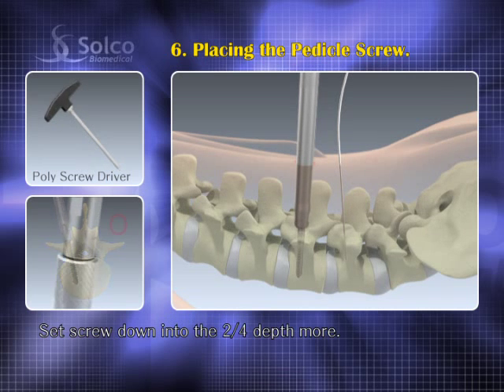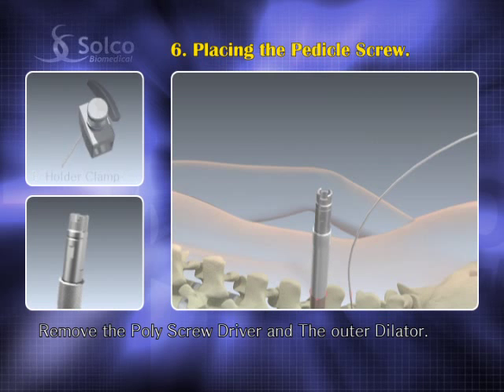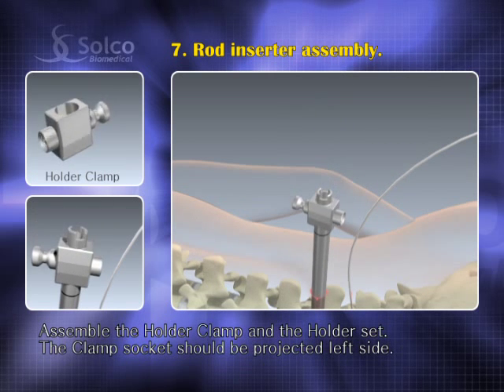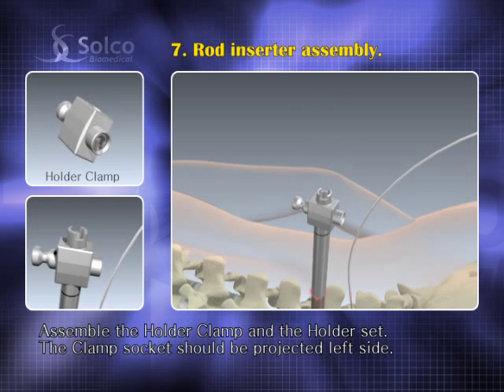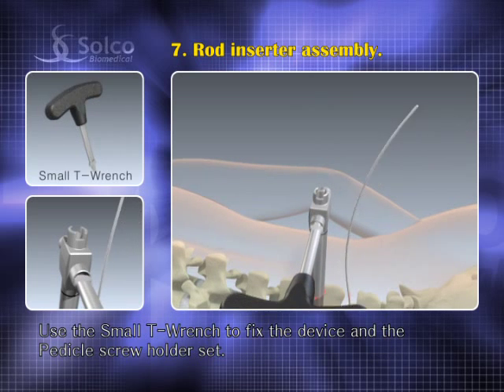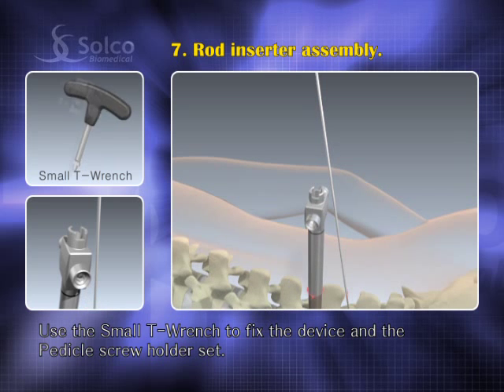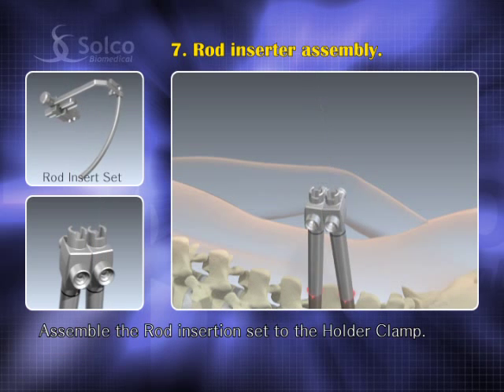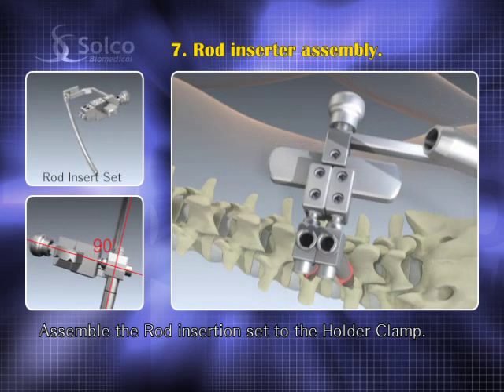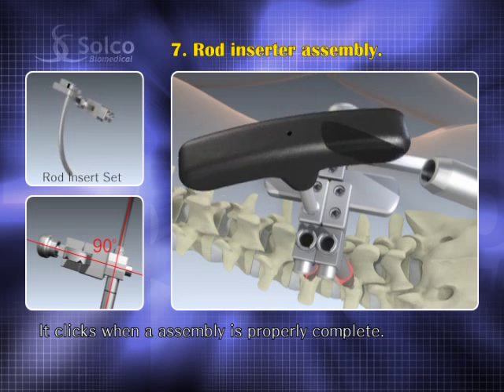After that, remove the poly screwdriver and the outer dilator. Assemble the holder clamp over the holder set and place the projected socket of the clamp to the left. The small t-wrench is for fixing the device to the pedicle screw holder set. Assemble the rod insertion set to the holder clamp and engage its socket to the clamp. It clicks when assembly is properly complete.